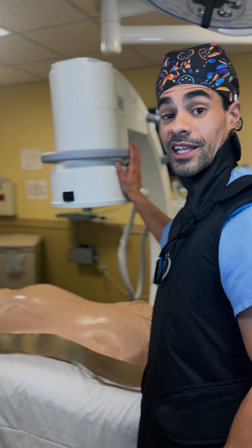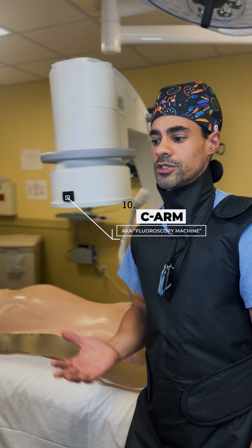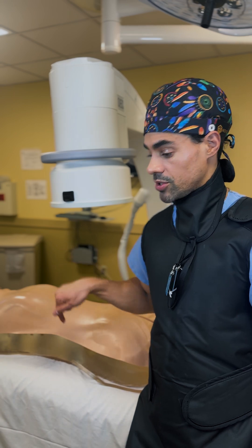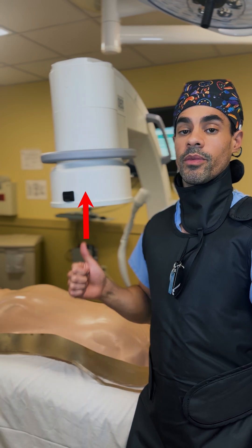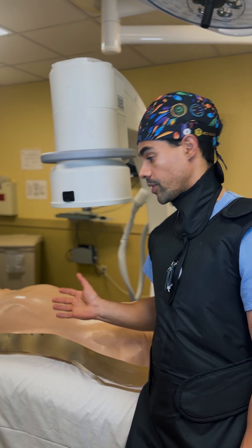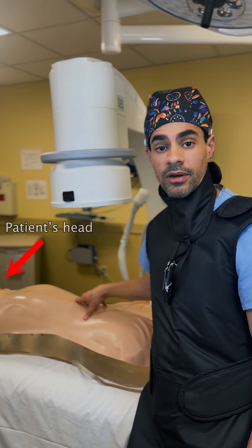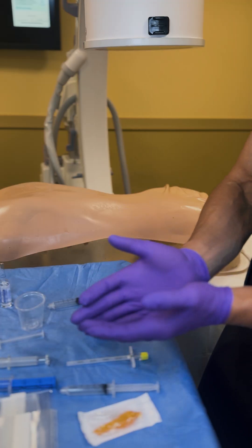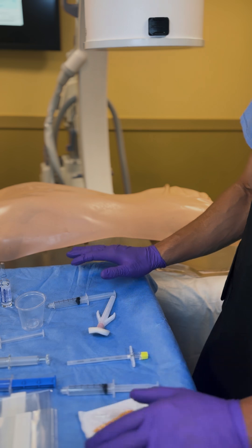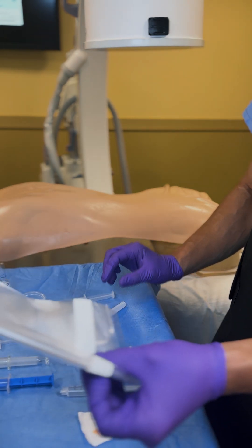Last but not least is the C-arm, or fluoroscopy as we commonly refer to it in the clinic. It's an X-ray machine with the image source at the bottom, shooting X-rays up, and the image intensifier at the top. Our patient is in the prone position with the lumbar spine accessible. We'll use sterile gloves for this procedure; for this demonstration I'm using nitrile gloves. We clean off the patient and then apply our drape.